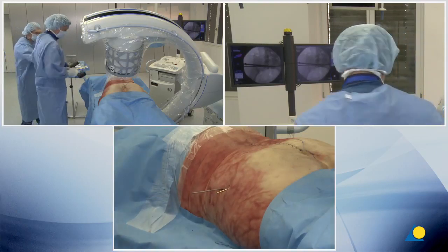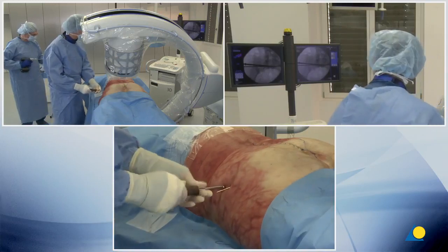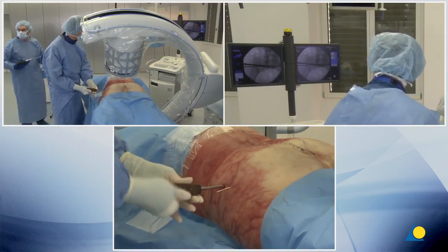It is acceptable to use a washer to prevent intrusion of the screw head through the outer table of the ilium and potential loss of fixation.